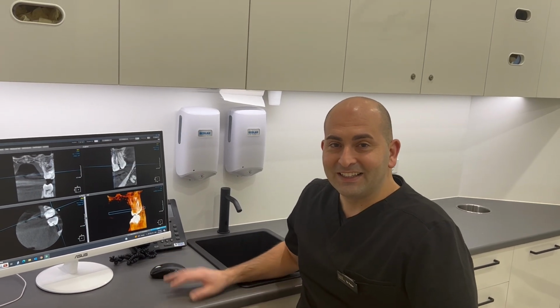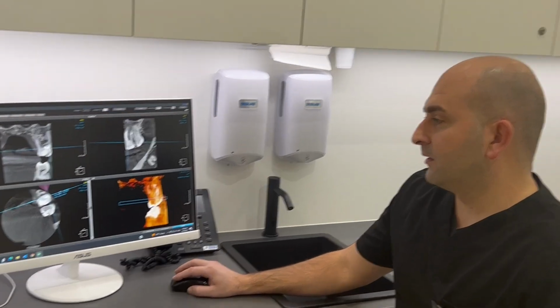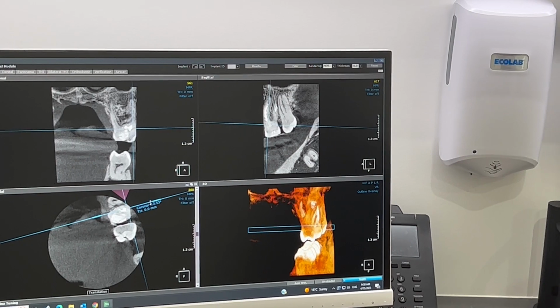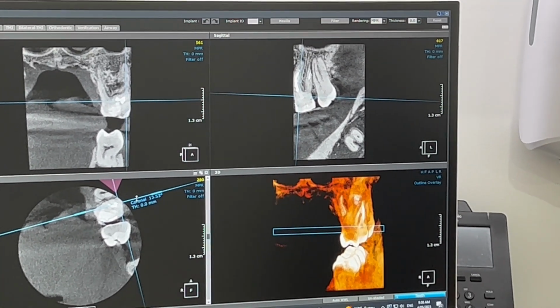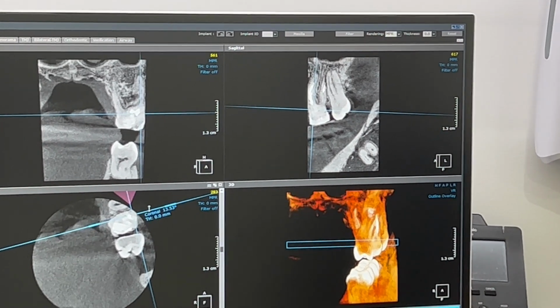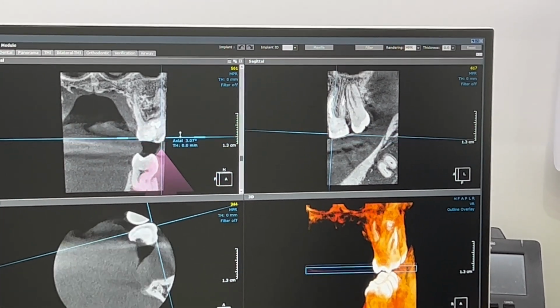We're here to have a look at your case of the week using the OP3D. Can you run us through it? Sure. We've got a really good case here with a CT scan. So basically it's a patient who had an endo treated quite well by another dentist. The patient was a dentist themselves as well.